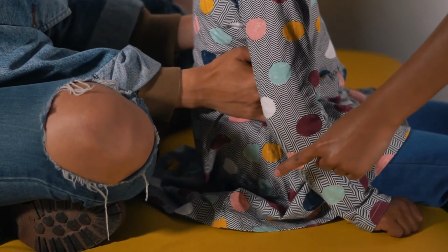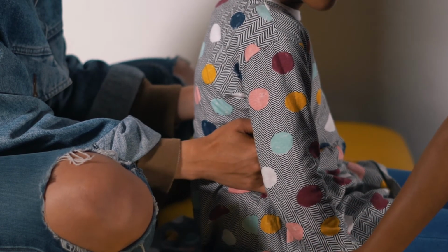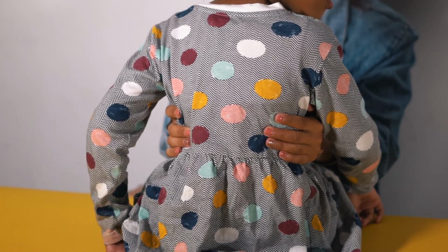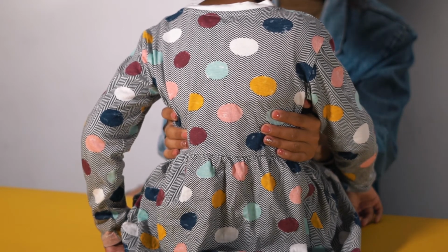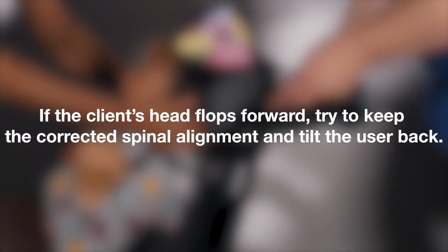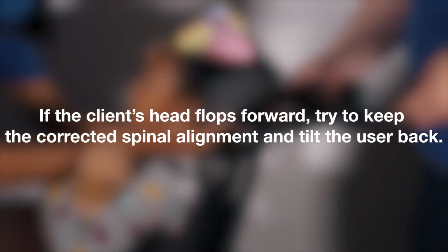Explain to the carer how to correctly support the pelvis and then swap places. Check that the spine is upright with the lumbar spine flat. The shoulders should be slightly in front of the hips. There may be no side flexion or rotation of the spine. Therapists assess spinal alignment and also check and feel how much support the client would need. The practitioner also needs to check if the head and neck are upright and vertical. If the client's head flops forward, try to keep the corrected spinal alignment and tilt the user back.